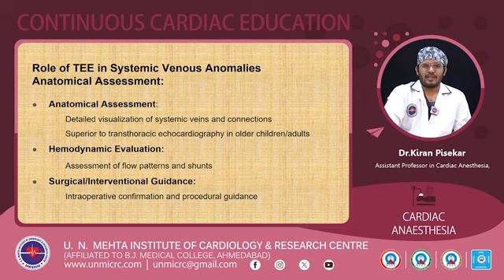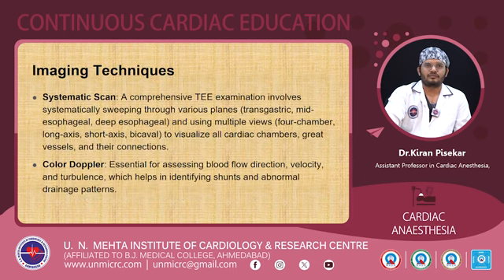Now what is the role of TEE in systemic venous abnormalities? We can do anatomical assessment, hemodynamic evaluation, and surgical or interventional guidance. In anatomical assessment, we can have a detailed visualization of systemic veins and connections. In hemodynamic evaluation, we can assess the flow patterns and shunts. And again, it is very important from the point of view of surgical and cath lab procedures.